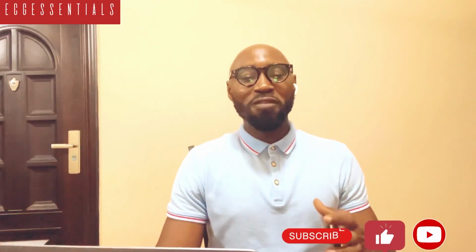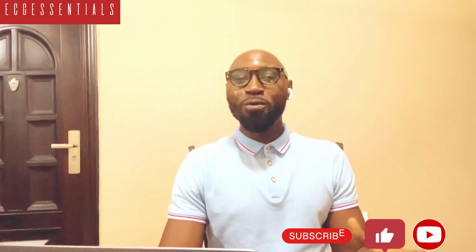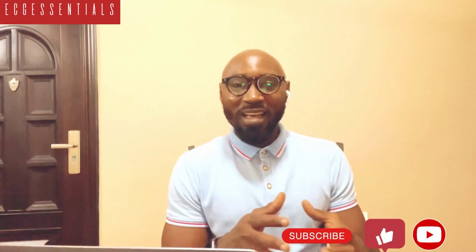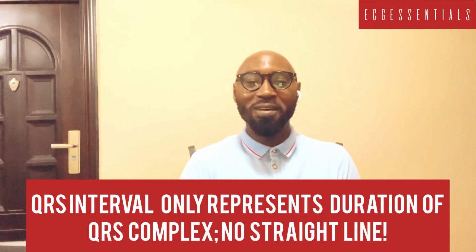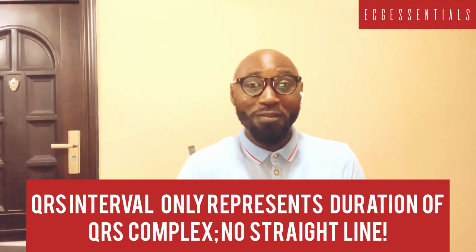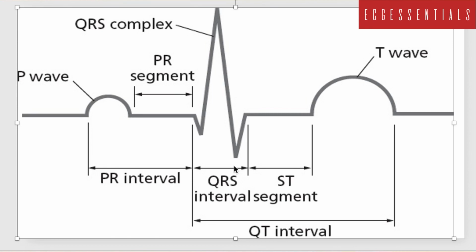Ladies and gentlemen, we have mentioned that an interval will usually have at least one wave plus a connecting straight line. But when we say QRS interval, it is an exception. It's an exception because QRS interval is just used to describe the duration of the QRS complex alone, without any connecting straight line.